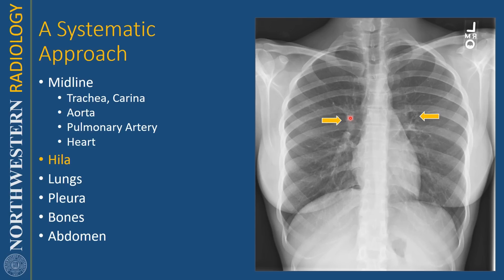I basically judge by eyeballing it, making sure that the hila are the same size and about the same density. If you see one hilum as a little bit more dense than the other, that could mean there are enlarged lymph nodes in that hilum, or that perhaps there's a mass or nodule superimposed over the hilum in the lung. Most of the time when you see an enlarged hilum, it is due to lymph node enlargement. Sometimes when the hila are enlarged, it can be due to pulmonary arterial enlargement.